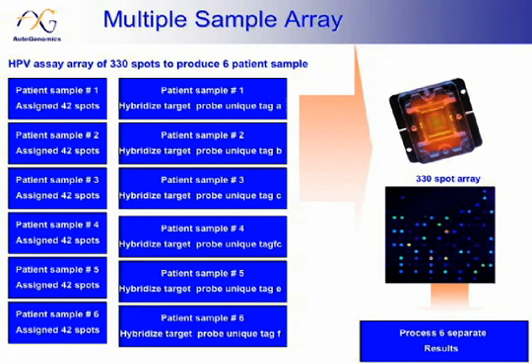We then take each of those patient samples and lyse the cells like it's done normally, and then we want to develop a target probe to look at whether type 16 or 18 are present, or whatever types are present. But during the development of that probe, we also assign a unique sequence to that set of probes, which is then allocated to that patient. And by making a complement probe onto the microarray, we are able to differentiate all 6 patients or 10 patients using the same microarray.